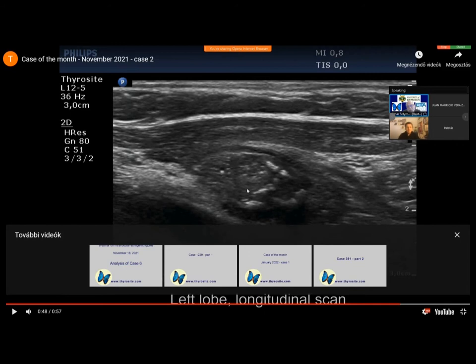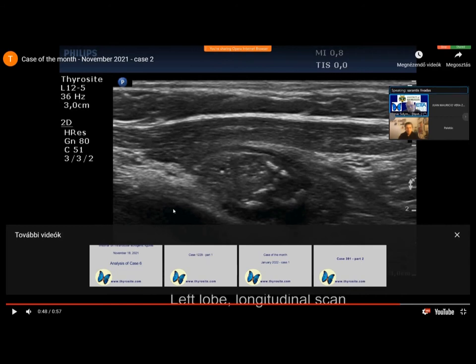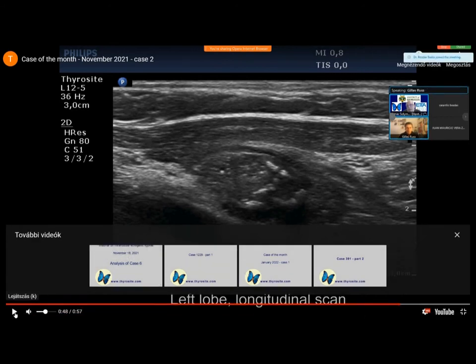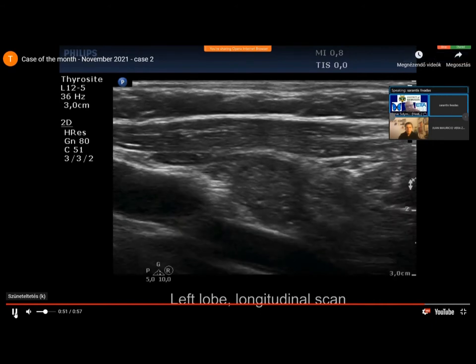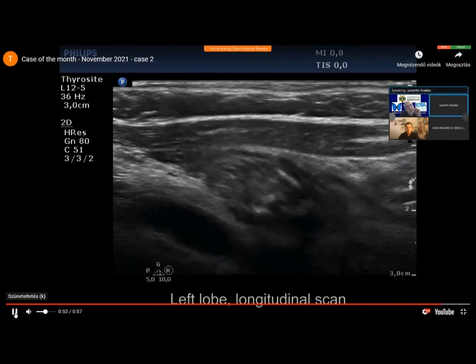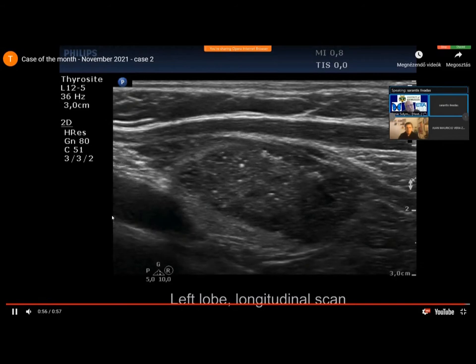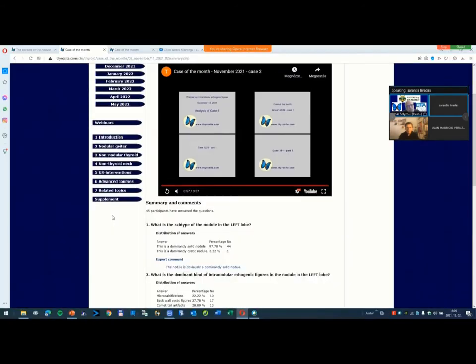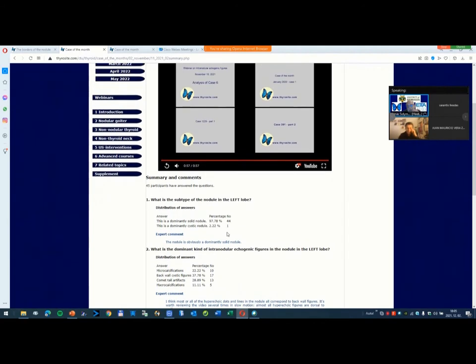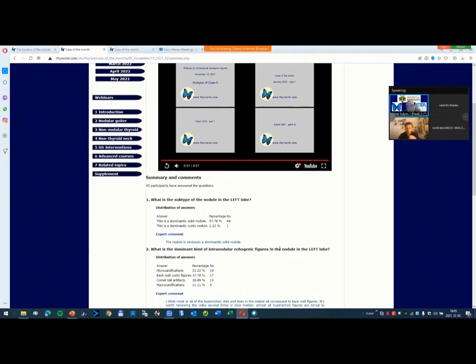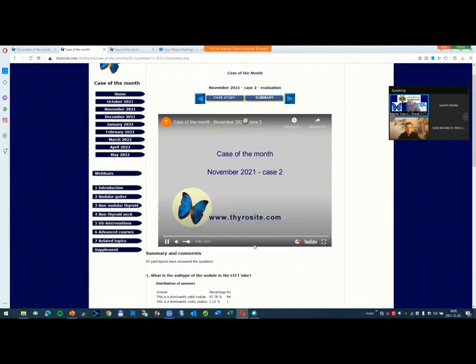Here, here, here. And there are both dots, granular forms, and lines. And this is not specific of microcalcification. I think that the dominant figures were the backward figures.